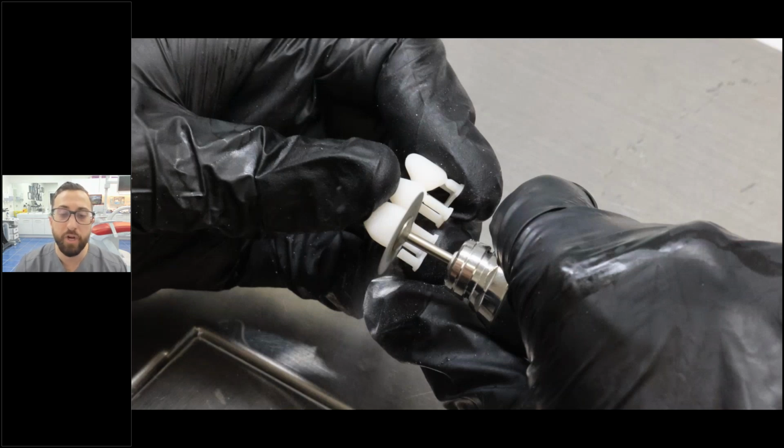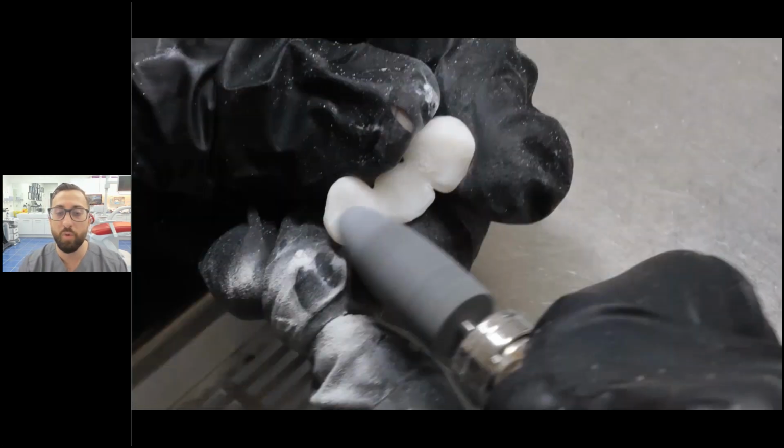Now, thankfully, because resins are resins, it's not like cutting zirconia. These are very easy to cut and polish. But just be aware that printing restorations, even though it's made to seem like some golden bullet, it really isn't what it's made to be. I think that printing and milling will both have their place in any digital lab and any digital clinic. They both have their strengths and weaknesses.